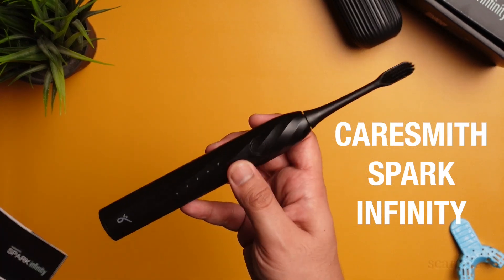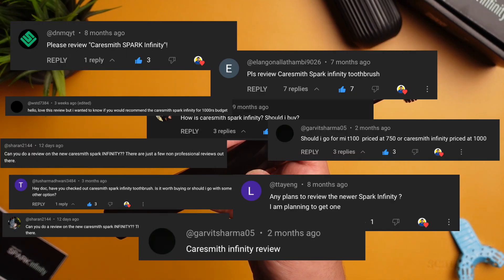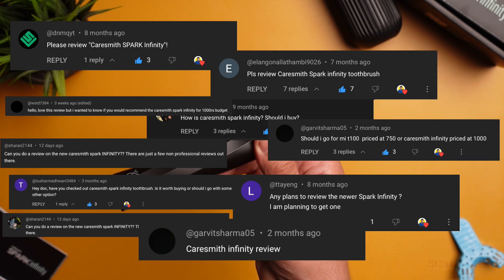This is the Caresmith Spark Infinity Electric Toothbrush, probably the most requested electric toothbrush people wanted me to review. I bought it a month back during an Amazon sale and have been using it since then, and I have some strong thoughts about it.